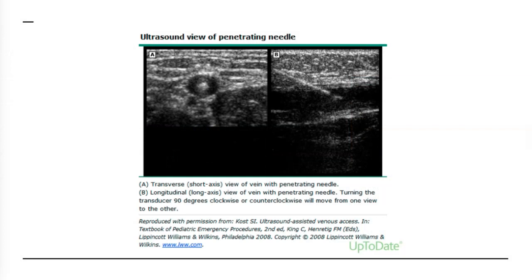When you advance the needle underneath the probe, the needle reflects the sound waves being emitted by the probe and will appear as a little white dot. You never want to lose track of that white dot. Essentially, ultrasound IVs are a video game where you are trying to get the little white dot into the big black hole — the vein. The image on the screen shows the white dot inside the vein in the transverse view.